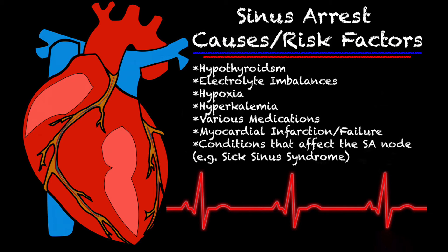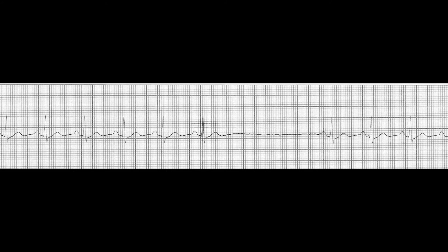Let's take a look at a strip with sinus arrest. Looking at this strip, you'll see that it looks like a very regular rhythm until it hits that part where there's no electrical activity, referred to as sinus arrest. That first beat after the sinus arrest is referred to as the escape beat, and sometimes this beat may not have a P wave — it just depends on what part of the heart the actual beat is coming from. Our SA node is referred to as our pacemaker, and our AV node is referred to as our gatekeeper. The AV node can take over, and there are different points in the heart that can actually take over to compensate for what the SA node isn't doing.